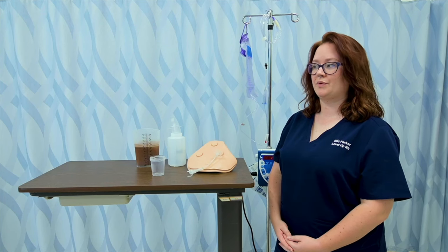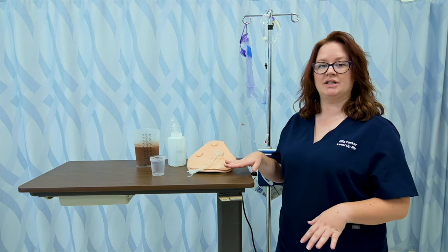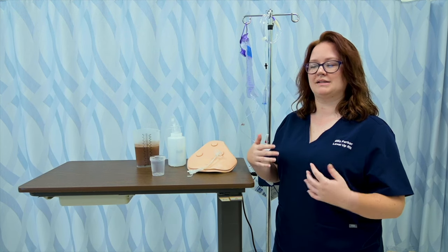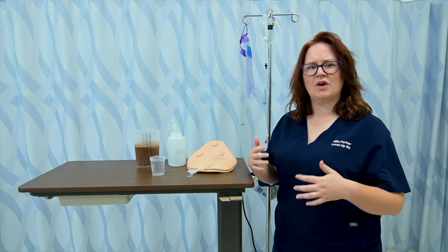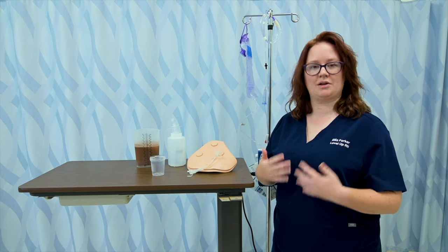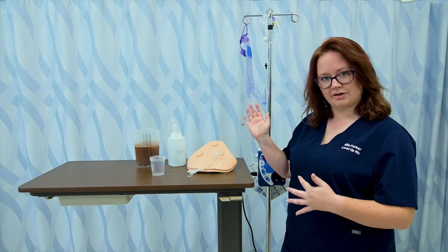Before starting or resetting a continuous feed, I want to make sure that my patient is sitting at at least a 30 to 45 degree angle because of that risk for aspiration. Even though they're not orally consuming, they're still getting contents in their stomach and there's still a potential risk for aspiration. So I want to make sure the head of the bed is at least 30 degrees.